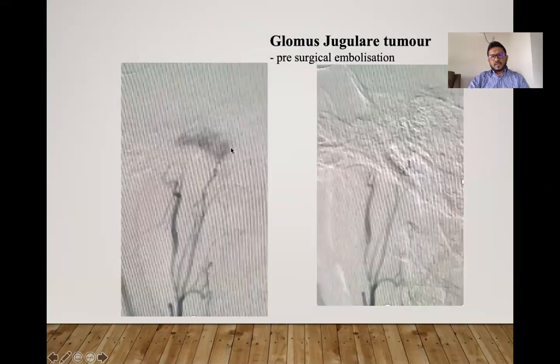This is some of the areas where you have very vascular tumors in the head and neck, especially the glomus tumors in the head and neck region. These are very vascular, and the ENT surgeons will always ask you to go ahead and pre-embolize before the surgery, so the blood loss will be less, and it will be very easy for the surgeons to take it off. Otherwise, there will be a lot of blood in the surgical field. It will obscure the surgical field, and you will always come out leaving a part of the lesion behind.